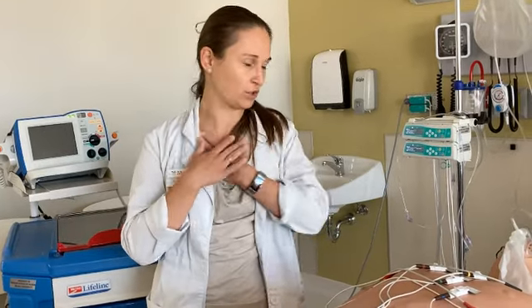Another important thing to consider when transcutaneously pacing a patient is analgesia and sedation, because as you can imagine, this is a very uncomfortable procedure, and it's quite painful to receive an electrical shock to the precordium, to the chest, at a frequency of 60 to 70 beats per minute. So normally we will make sure that the patient has IV access, and that analgesia and maybe sedation is prescribed.